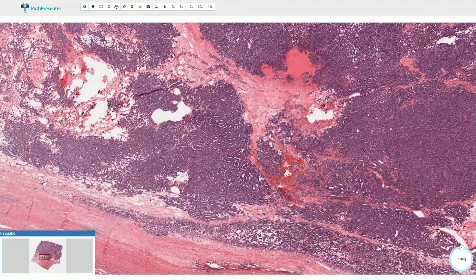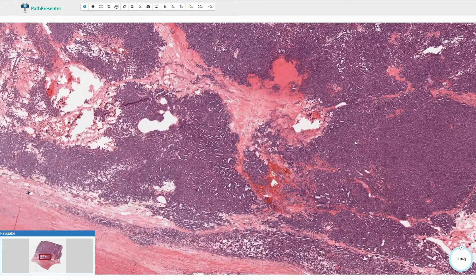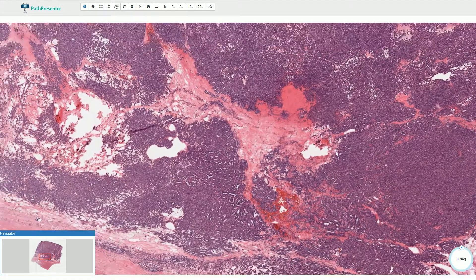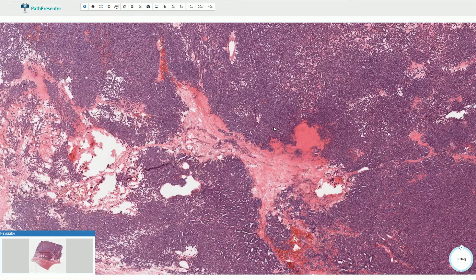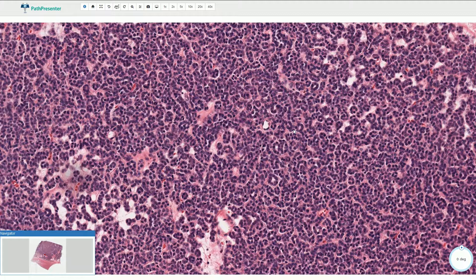All of these cells have very little amount of cytoplasm, so we mostly see the nuclei — that's why it is characteristically basophilic and dark blue. On higher magnification we can see that the tumor is characteristically composed of tightly packed small tubules, which are separated by just a small amount of paucicellular or acellular stroma.